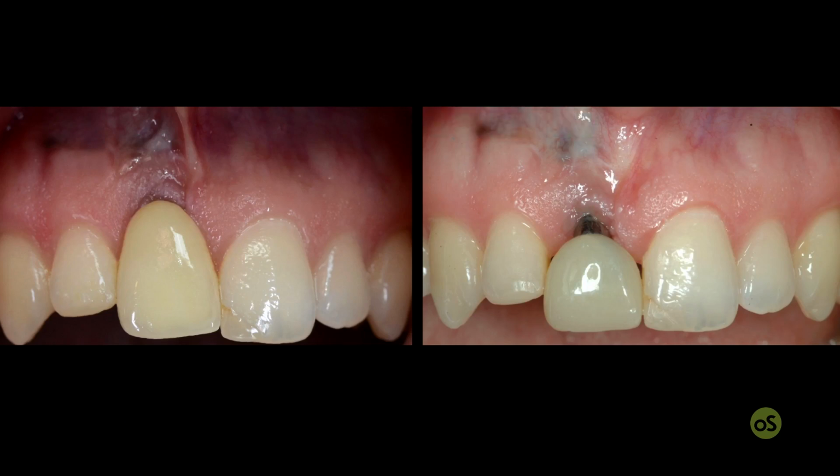And so if you look at what happens in 2-3 months' time, it's almost incredible. The whole recession was almost completely solved by the soft tissue itself. The improvement of the quality of the keratinized tissue and the thickness of this keratinized tissue is clinically evident, so you can use a thinner graft and use a good amount of keratinized tissue to stabilize your flap.